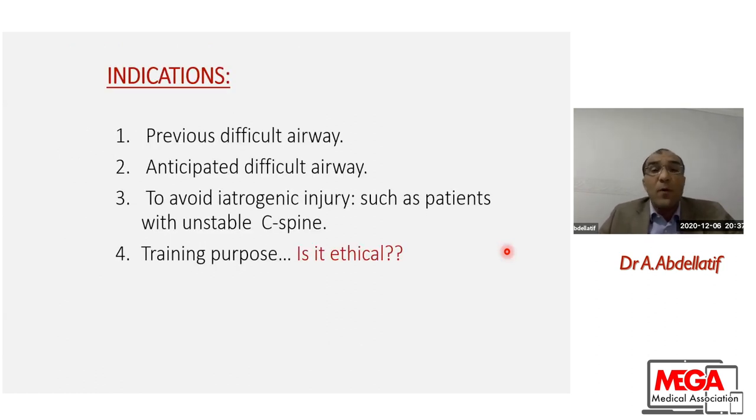Indications of the fibroscope, of course, we all know it. Previous difficult airway, any case of anticipated difficult airway, to avoid iatrogenic injury in case of instability of the cervical spine.